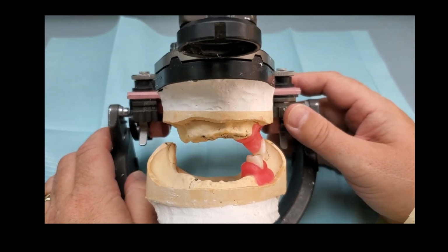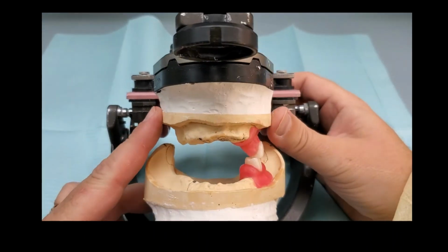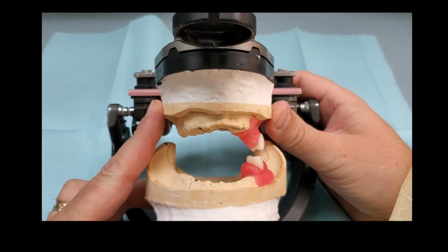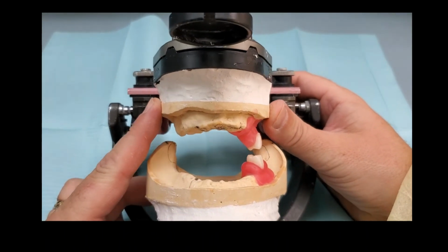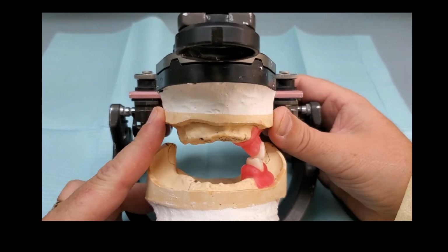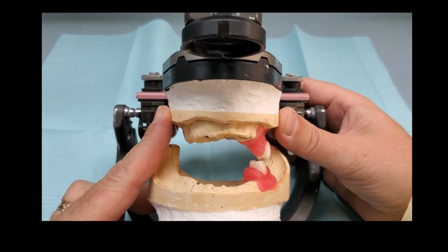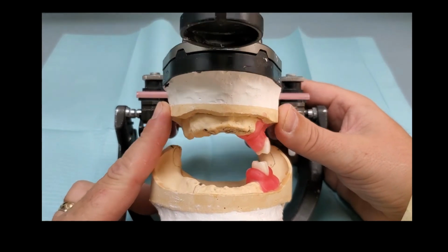And I'm telling you, I don't do this anymore. This is what I do. I start taking an articulator and I'm doing a chew cycle, and I'm watching how the teeth are going, and I'm checking the hit and slides. And as I'm moving the articulator, you can see the cusp is doing different things within the fossa.